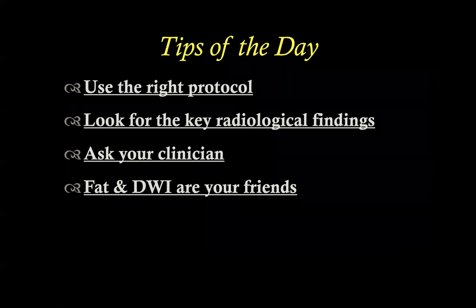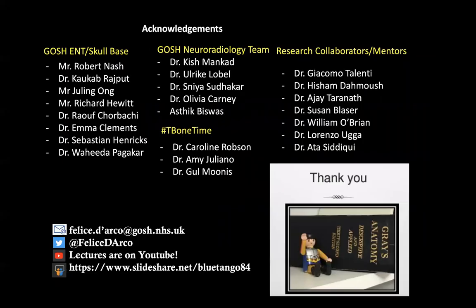So what are my tips for the day? Use the right protocol. We did write, with the help and the endorsement of the European Society of Head and Neck Radiology, a protocol consensus paper for head and neck pathologies in children. Please use this protocol, send us feedback. Look for key radiological findings, but expand from that, looking for other elements of differential diagnosis. Ask your clinicians how the lesion looks or behaves over time. And remember, fat and DWI are your friends.